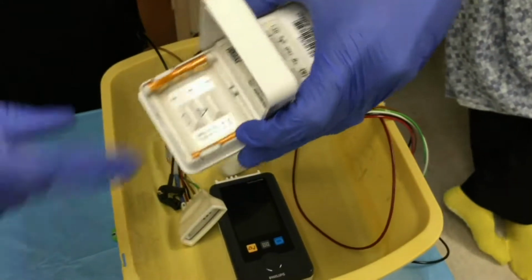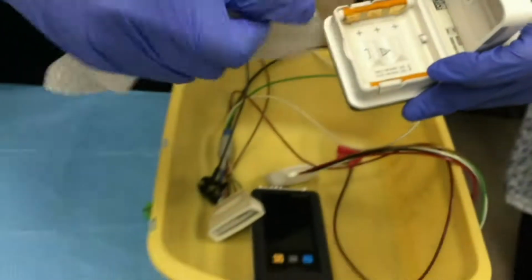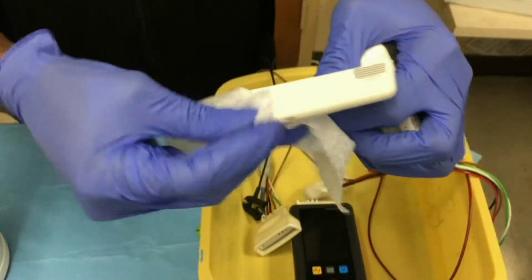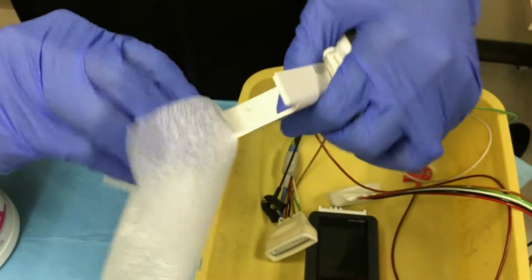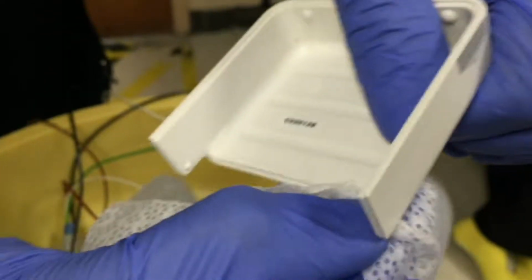Avoid cleaning the battery dock unless you see that this area is visibly soiled. This is because the Cavicide wipes are corrosive and will damage the battery dock. Disconnect the cover piece of the battery dock by simply pulling it apart and clean the outer perimeter, as well as the inside area of this piece. Pay close attention to the top perimeter and inner crevices, as debris is often hidden in these areas.